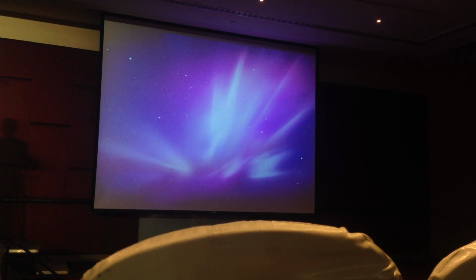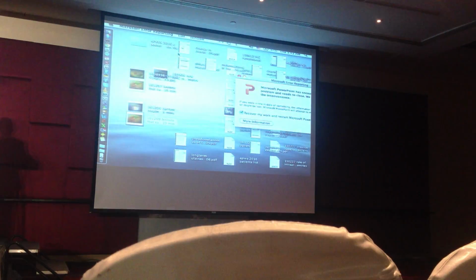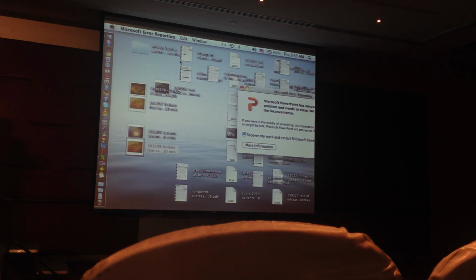With choroidal osteoma, the key to differentiating it from melanoma is to do the ultrasound. You can see the shadow of the calcification.